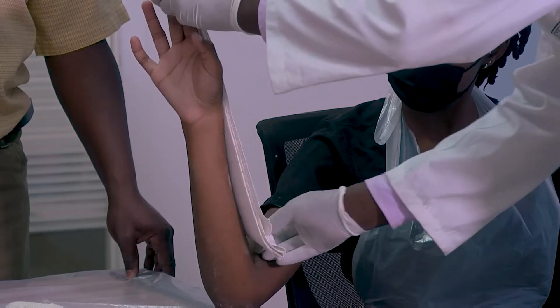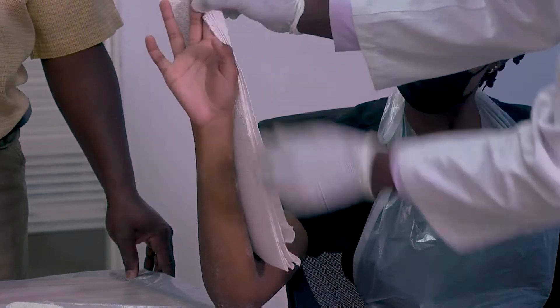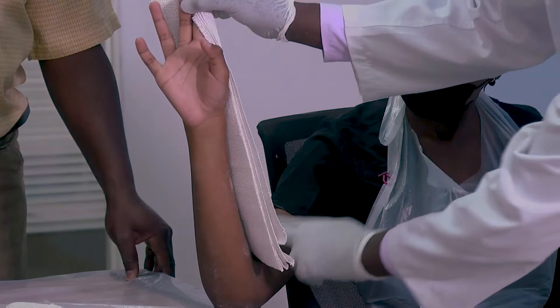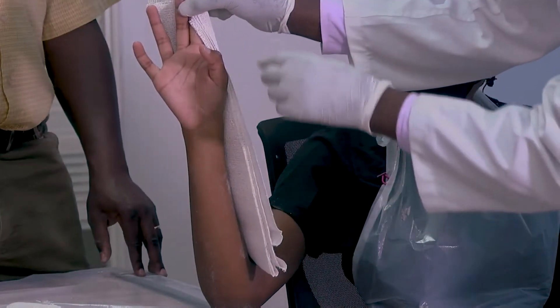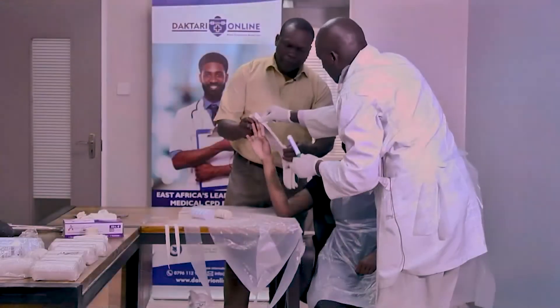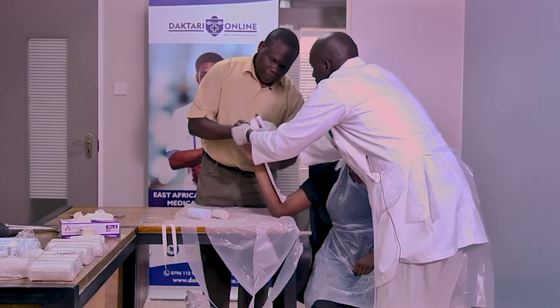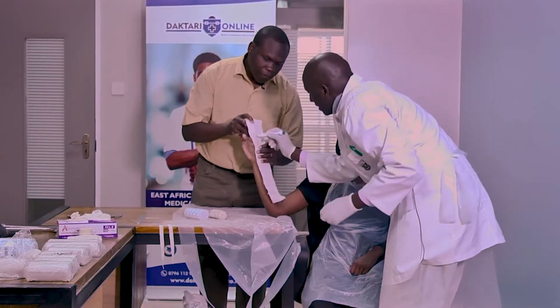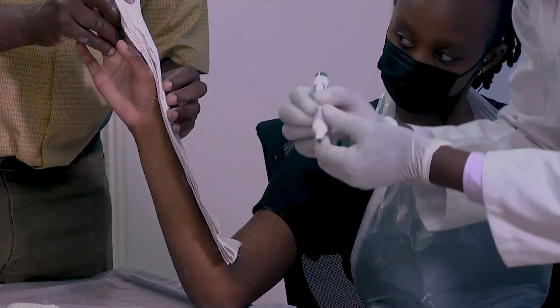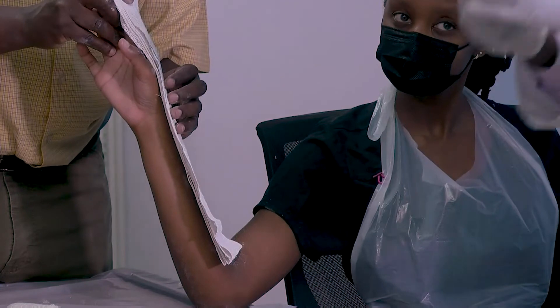The radial gutter splint is passing through the radial bone. You can see the measurement coming underneath — making sure that it is below the elbow. We are going to fold this so we are able to cut. I've come up with a mark — I want to show something here. When you measure there, ensure the thumb space — we are going to cut here because of the thumb. That's why the marker pen is very important.